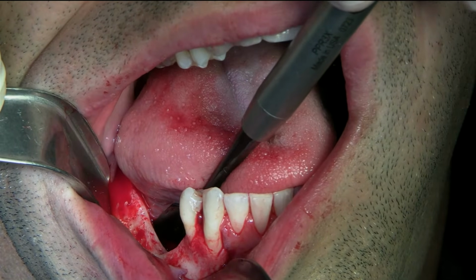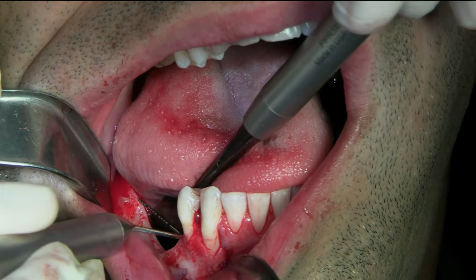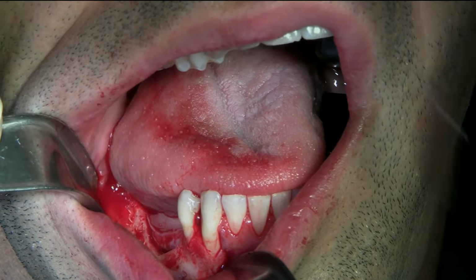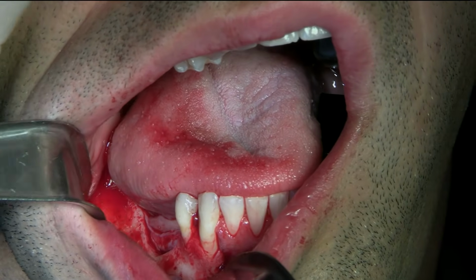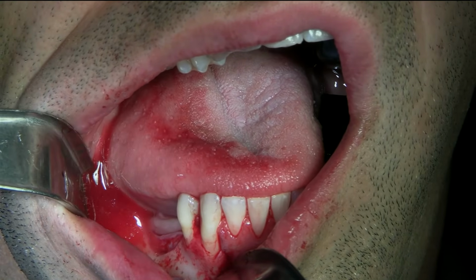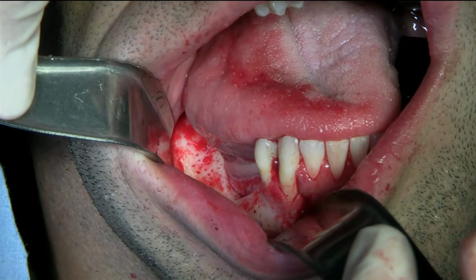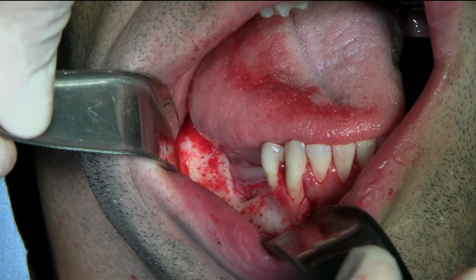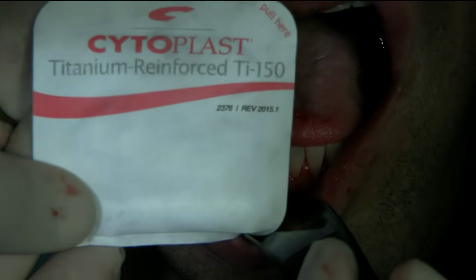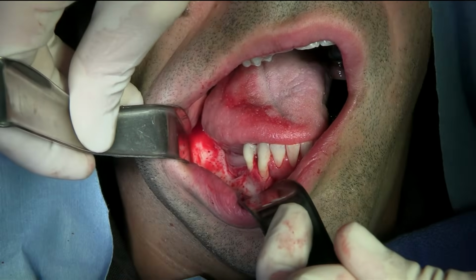Okay, we're ready for the 10 screw. I can start already trimming. So let's get from here through. Okay, you can just hold this one. You don't need to hold it. Hold this one, so you can see that. And I'm going to start trimming the membrane. So that's your membrane, the cytoplast, titanium reinforced, and so I've got a 150.